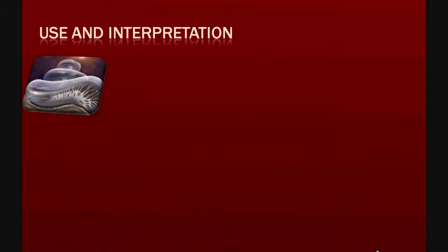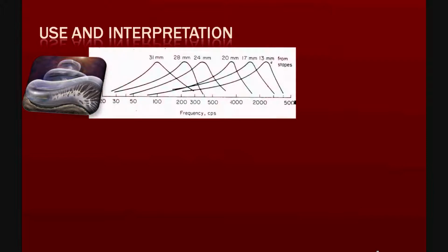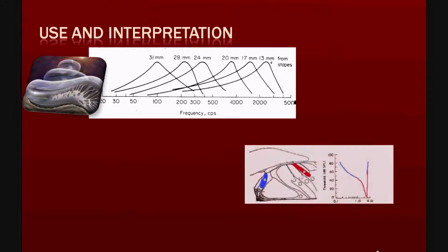How to use and interpret the test results. This test assesses what is presumably one of the most essential features of the cochlea, namely the frequency resolving power. This relates to the tuning curves. Tuning curves are input-output functions of regions, or hair cells, in the cochlea. In the normal cochlea, tuning curves are very sharp.